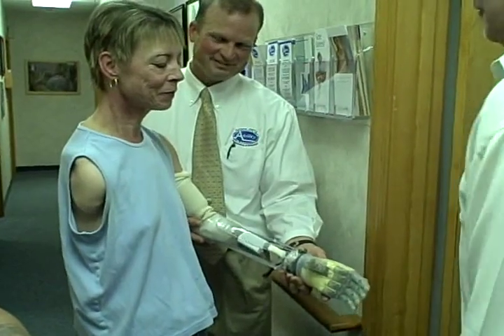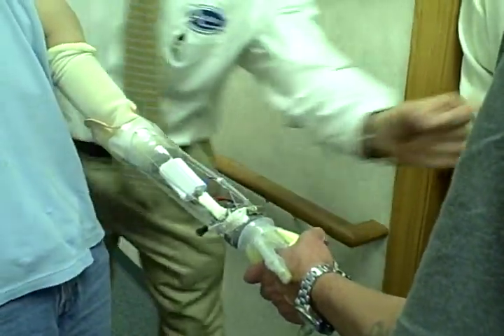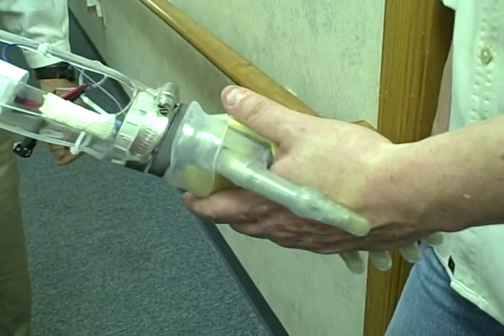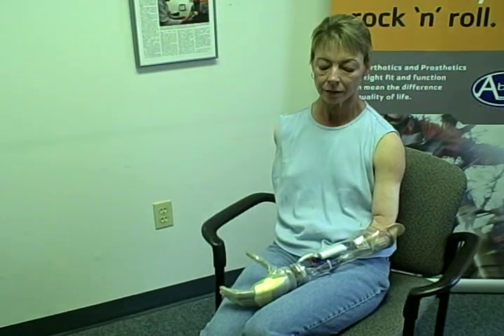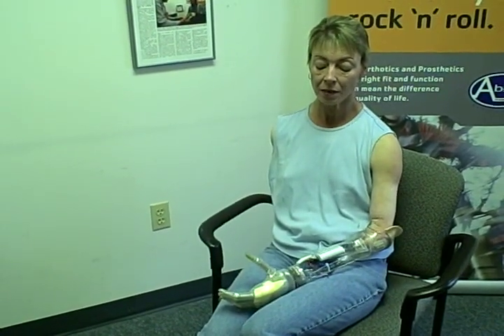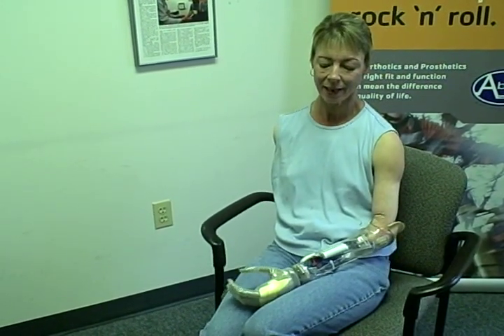I was ecstatic and amazed at how quickly I was able to open and close and move the fingers and the thumb on the i-limb. It feels so close to the real thing — it's the next best thing, and you couldn't ask for any more.